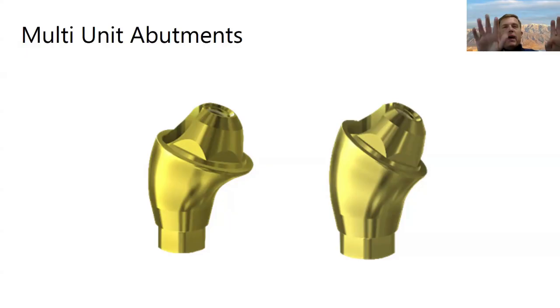Now, the problem with that is that it's not just the implants that are tilted. Oftentimes, it's the channel through the tissue as well. So as we're trying to put this direct-to-fixture prosthetic on, we're having to thread the little projections into those tissue columns that can be a little bit challenging. And it's not just one time. Every time you take that prosthetic out, you get a fight with it again. Most people I know who've done that a couple times are like, this stinks. I don't want to do this again.